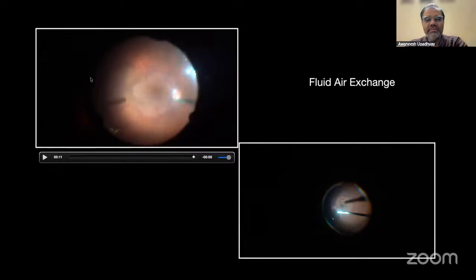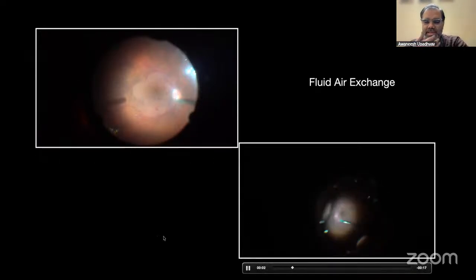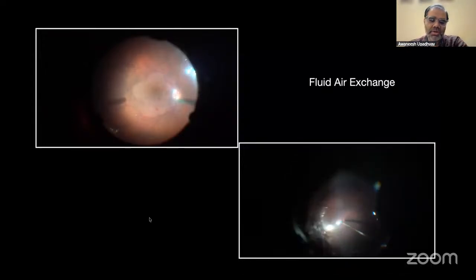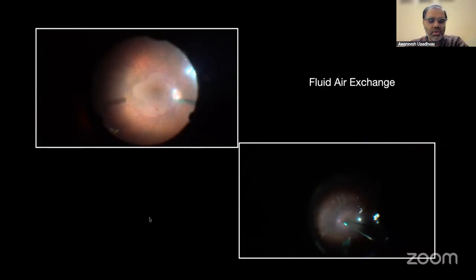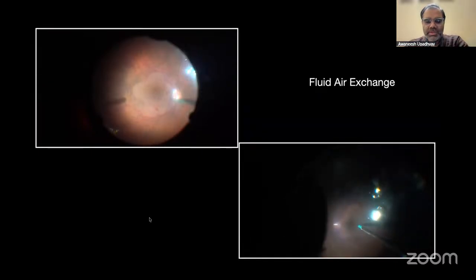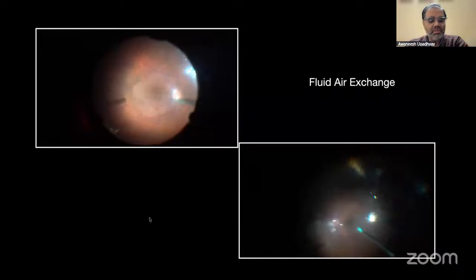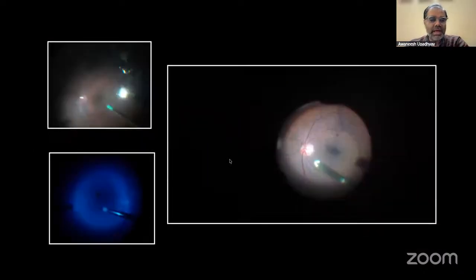So how do you see whether it is dry or not? It is the meniscus of the fluid which disappears. So you can see that with repeated passes, it will disappear. The second one is where I prefer waiting for a minute or two, letting the peripheral fluid come down. And at times I can use this sort of a wick in perimacular areas, and if there is any fluid, that can be aspirated. I would absolutely agree with Dr. Mohit about the foveal area, where people aspirate over the fovea, because I have burned my fingers.